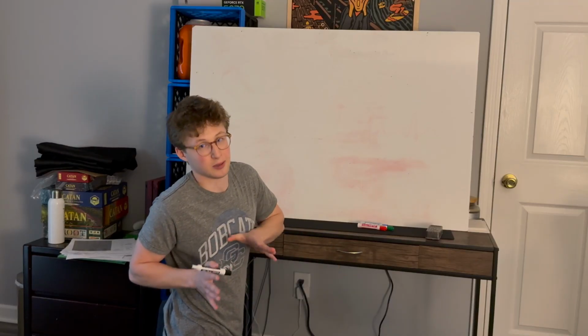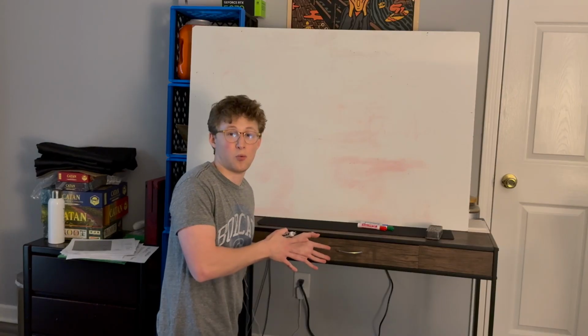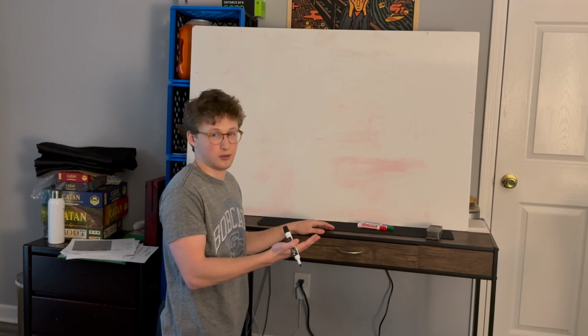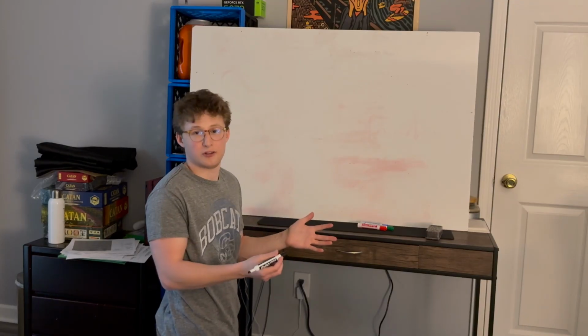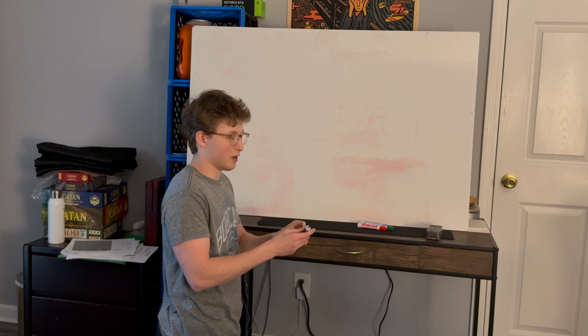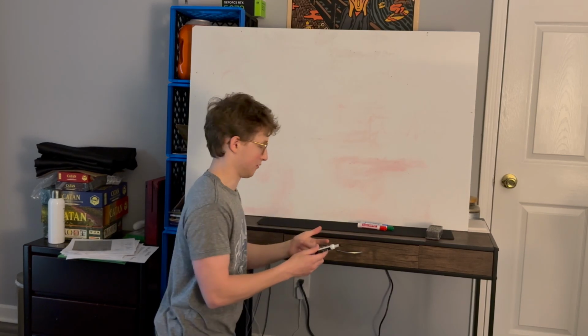They're leaned over a certain way. The heart is now being pushed a little, let's say they're lying left lateral and the heart is now closer to the sternal wall, the ribs. That'll make things look a little different. Everyone's heart is different, right? So it's really important to be able to not just memorize one picture, but to be able to understand any picture you're looking at, okay?